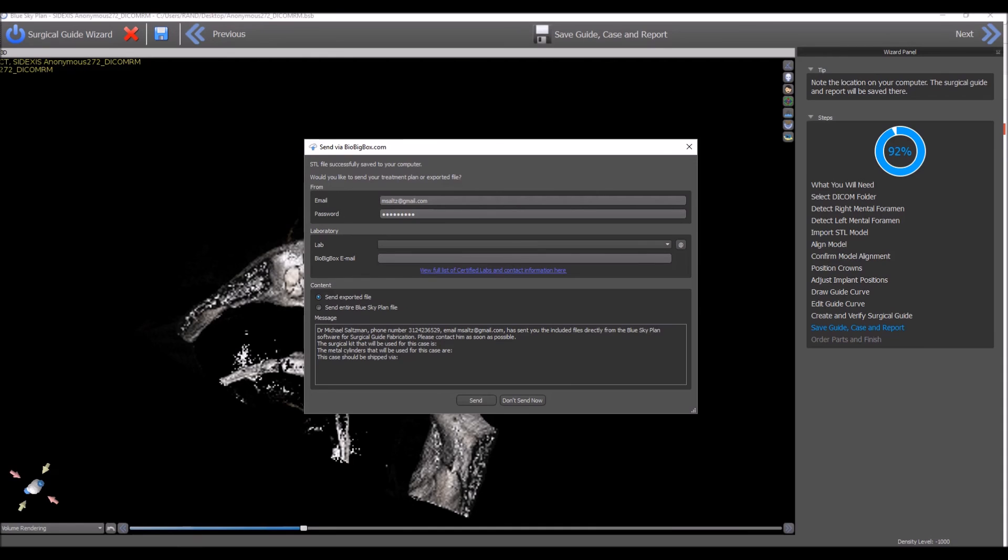In addition, once the recipient downloads the file, you will receive another email confirming that the recipient has downloaded the file so you're fully informed at every step of the process.